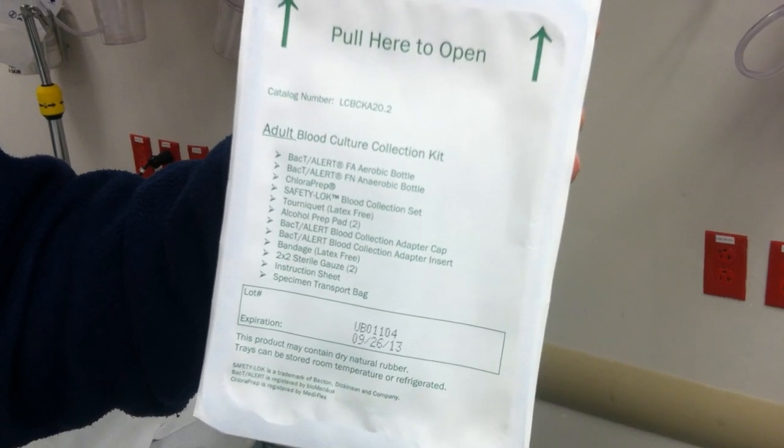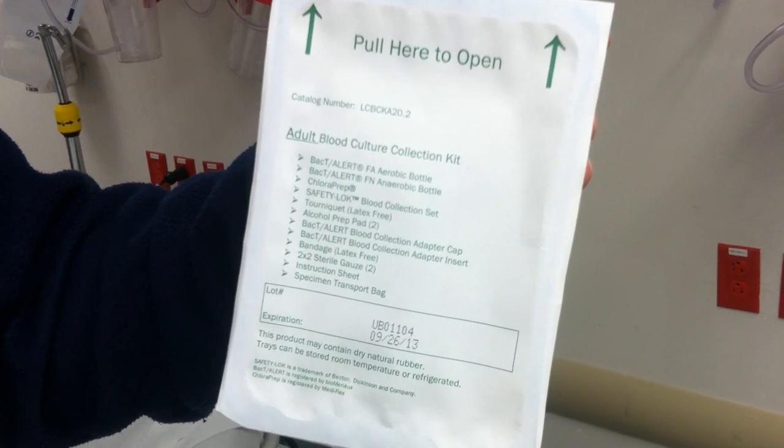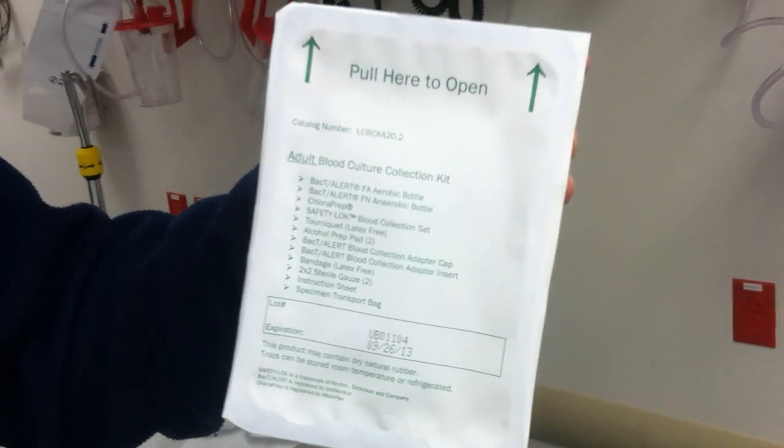It also includes the collection set, which is a butterfly needle, a tourniquet, alcohol pad, a bandage, 2x2 gauze, gloves, an instruction sheet, and a specimen transport bag to send the specimens to the lab.